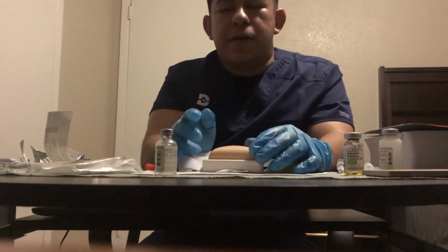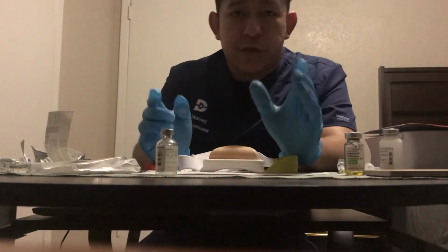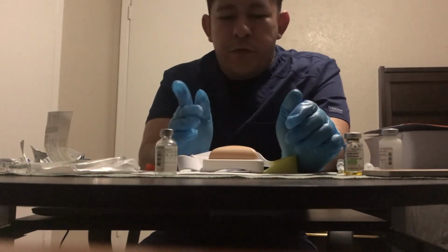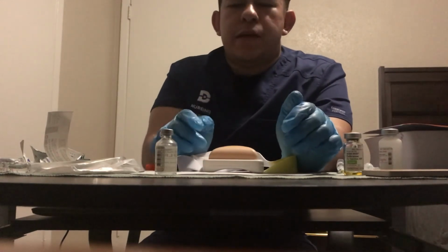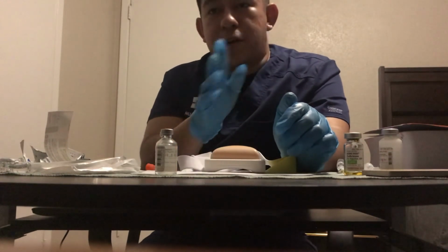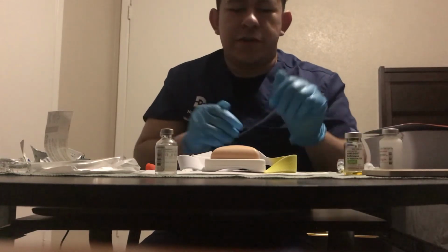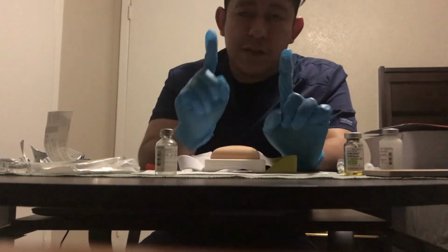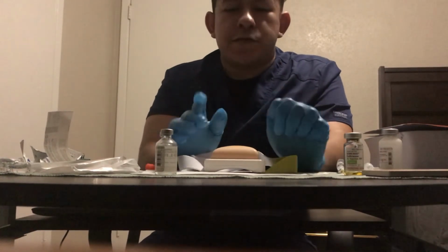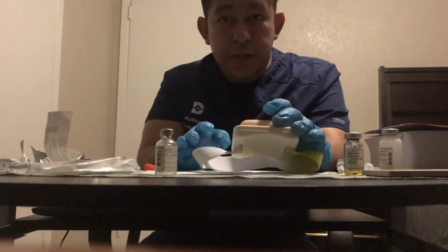If not, then lower the bed back down, put the rails back up, give them the call light, make sure it's within their reach. I would let them know, hey, I'll be back in 30 minutes, but if you need anything before then, let me know or hit the call light. And then I would walk out, do my hand hygiene as I walk out, take off my gloves, do my hand hygiene for 30 seconds, and then do the 6th check, or the most important one, make sure you document everything you gave, to who, the time, etc. And that's pretty much it on the injections.